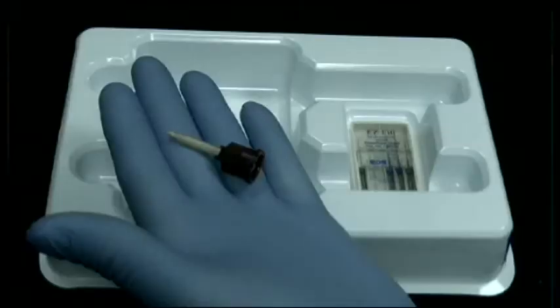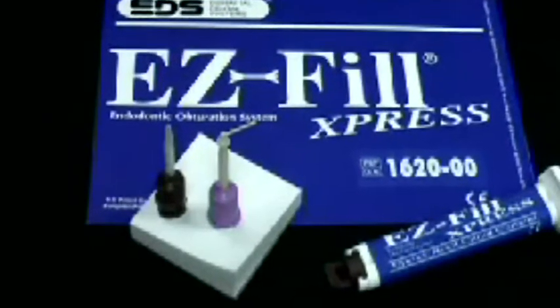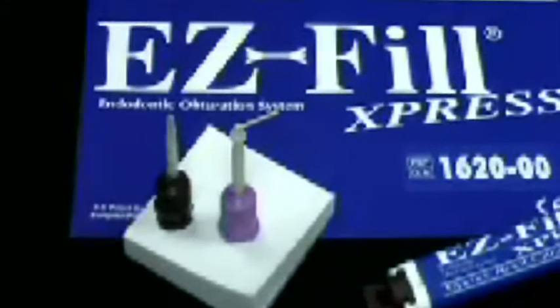Now, this is what the mixing tip that comes in the kit looks like, and I'm going to recommend that you get a different tip. In next week's Root Tip of the Week, I'm going to show you exactly where you can obtain that tip. But in the meantime, here's what it looks like. Here's the mixing tip that comes with EasyFill on the left, and the one with the purple base is the one I'm going to recommend that you get.